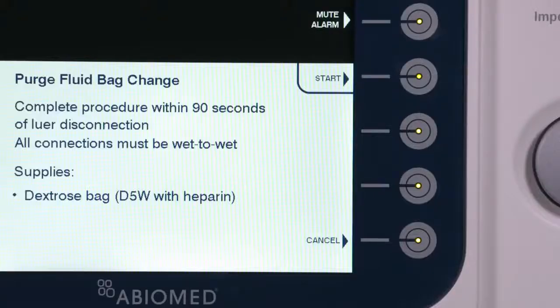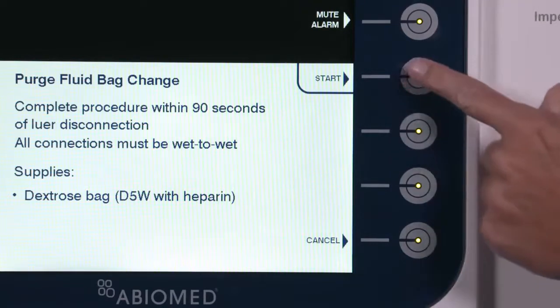This procedure should be completed within 90 seconds. The supplies needed to complete this procedure include a bag of dextrose 5% in water with heparin. Press Start to begin the procedure.